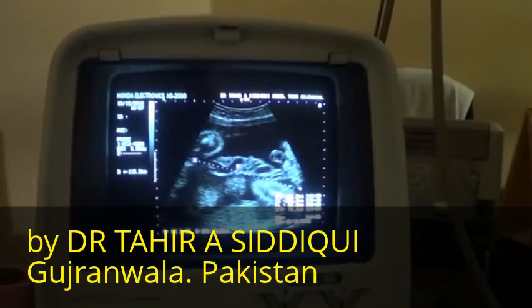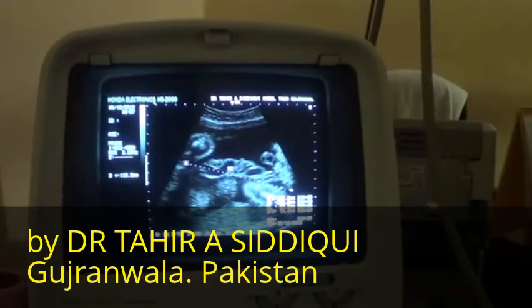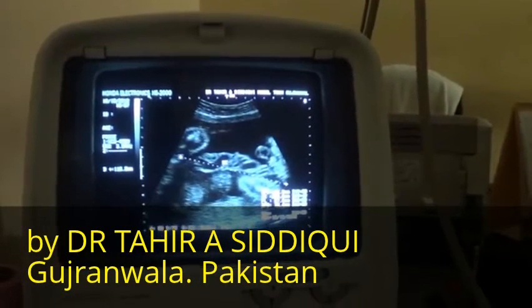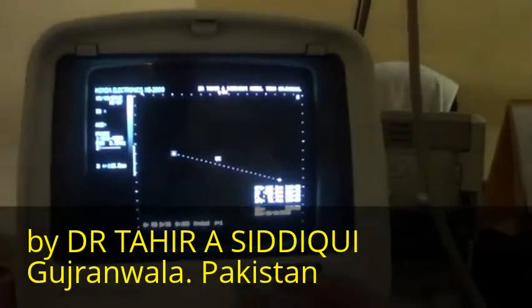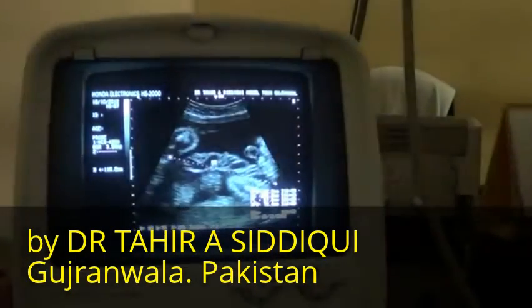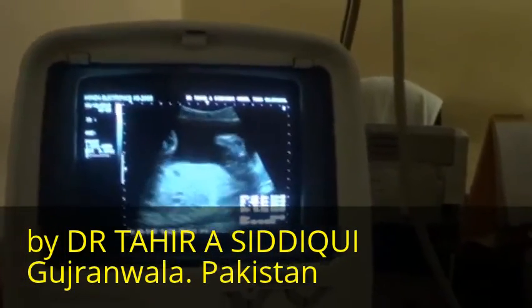Above 8 centimeters is considered normal. So this is normal length of the umbilical cord, having 2 arteries and 1 vein, which is the requirement for a normal umbilical cord. So the umbilical cord is normal.